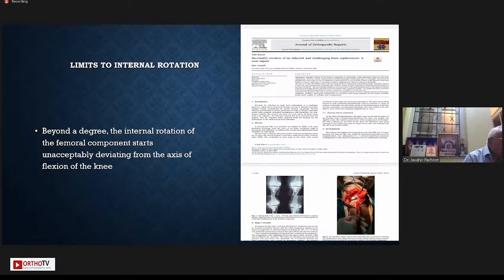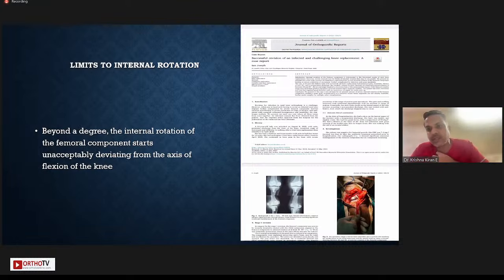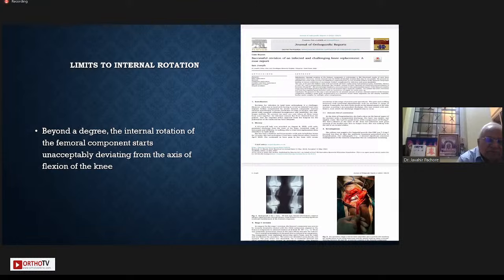Krishna Kiran, any comment on this? 100% agree with you, sir. Your thoughts? So we have been doing robotics for the last 4-5 years. What I find is that most of us actually do what is an adjusted mechanical alignment. So we are within 3 degrees of neutral. We can play around 3-4 degrees maybe, and you're trying to balance the knee. We're not trying to leave it unbalanced, because we know, as Leo rightly pointed out, if you leave the knee unbalanced, it will fail.